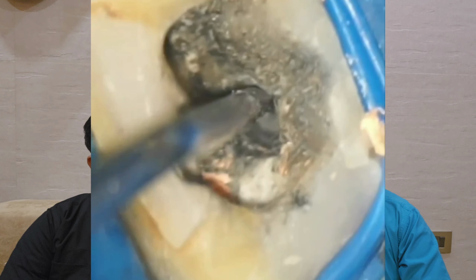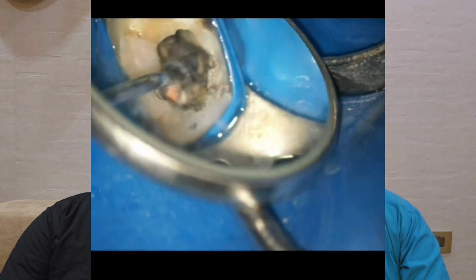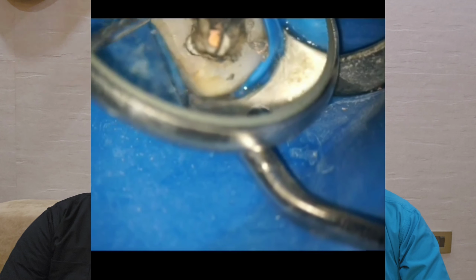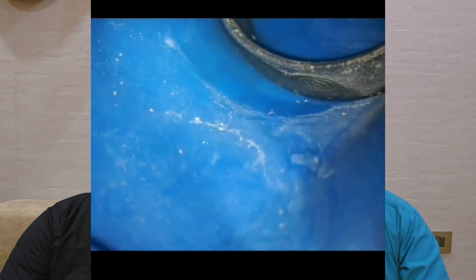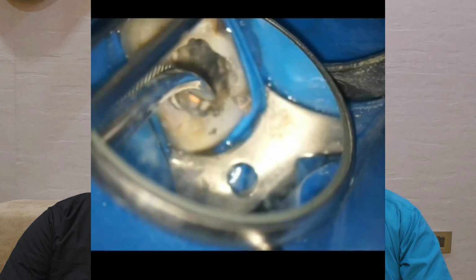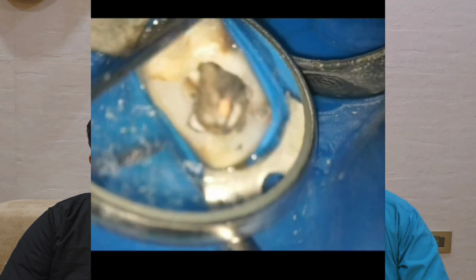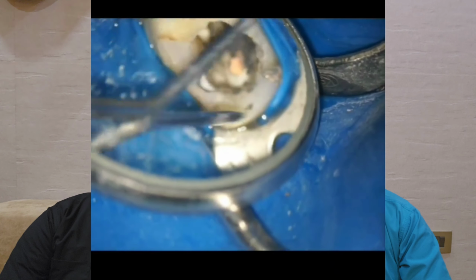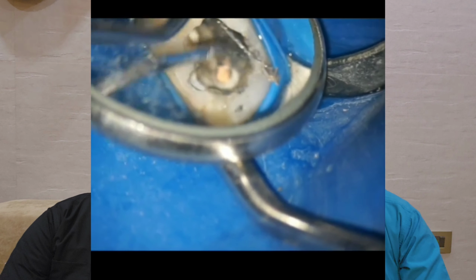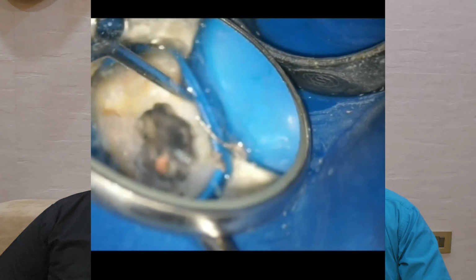But what we have seen in many cases is that it is just left. The patient is not informed about it, and that becomes a severe problem later on because the tissues get infected underneath it, which are not removed due to the instrument blocking that area, and that causes infection and problems. We will put up cases, and then it becomes again a severe complication. So even if this is not a very avoidable complication in some cases, the management is very important.